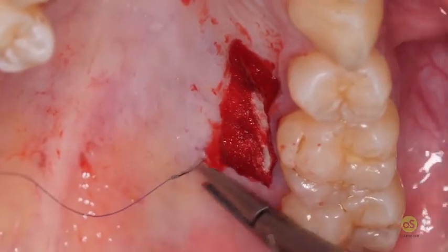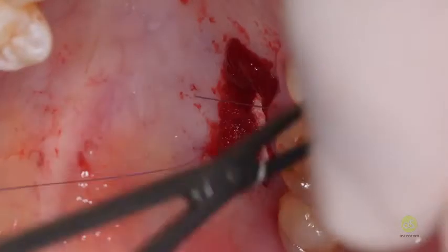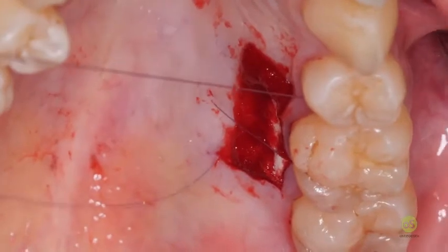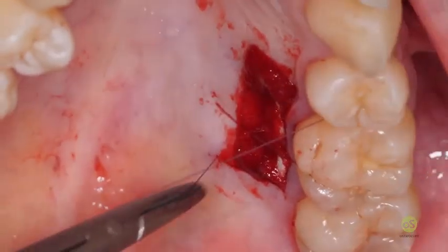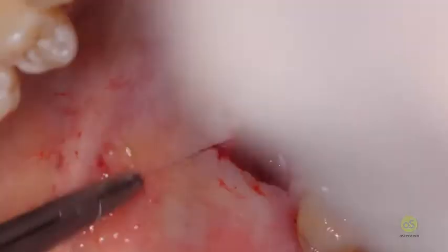So it's very, very easy also to stabilize mattress suture starting from distal to mesial. You turn the suture around the buccal aspect of the corresponding tooth. You fix the surgical knot apical and distal. You should try to close as much as possible the surgical knot distal and apical, because as I told you already, the blood comes from here.